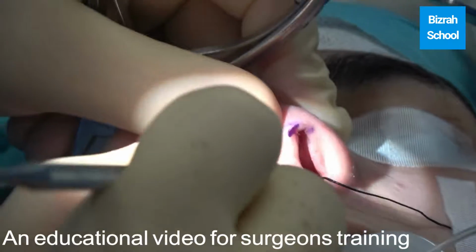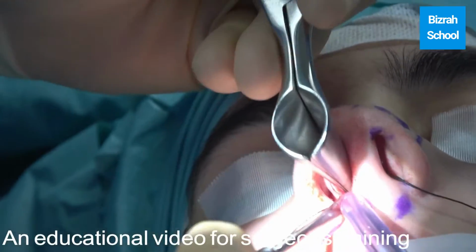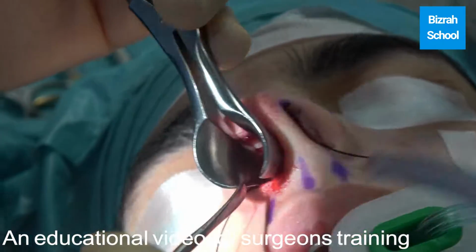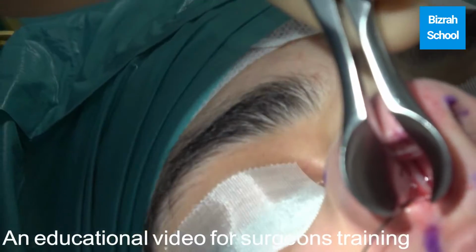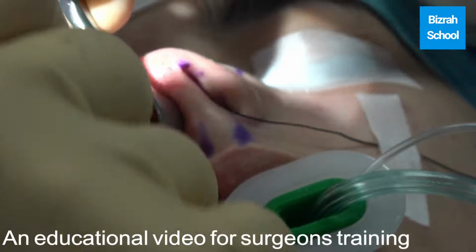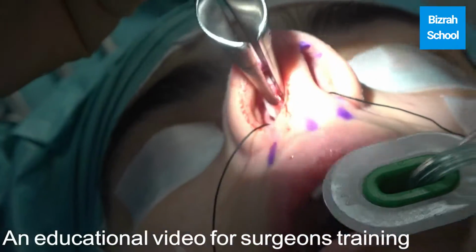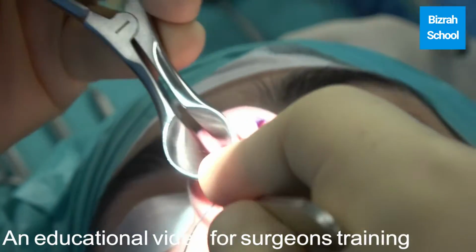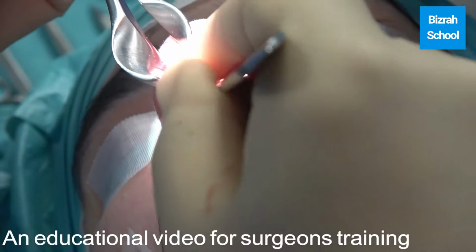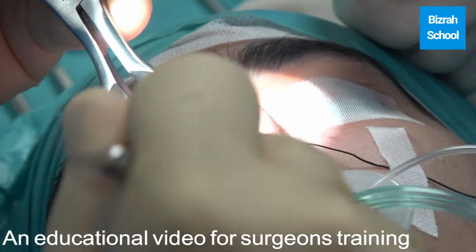We are elevating the left perichondrial flap, as you see there. This is the cartilage, the white. See the white inside? Okay, the cartilage. So the left perichondrial flap is elevated fully. And now we'll go about 1 centimeter behind, or even more, and we try to elevate.